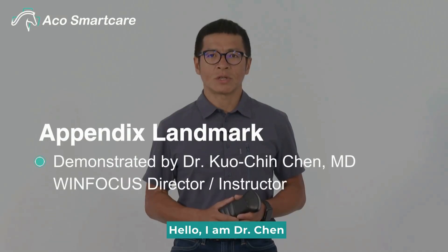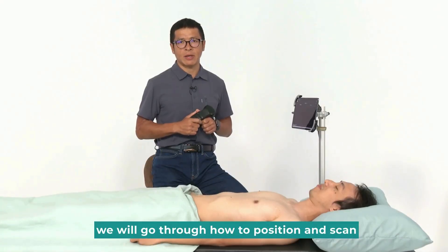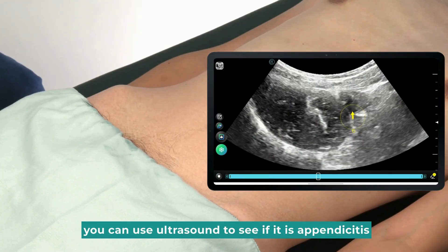Hello, I am Dr. Chen. Today, we are going to learn about Appendix Landmark. We will go through how to position and scan. If you have a patient with pain in the lower right abdomen, you can use ultrasound to see if it is appendicitis.